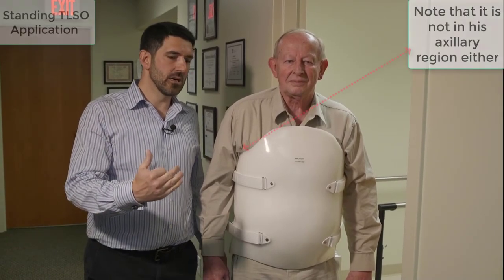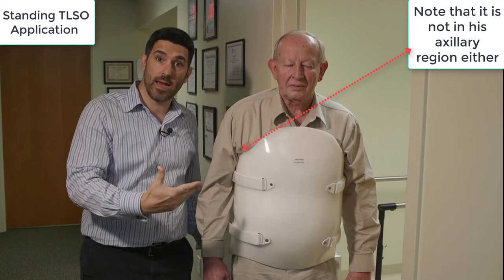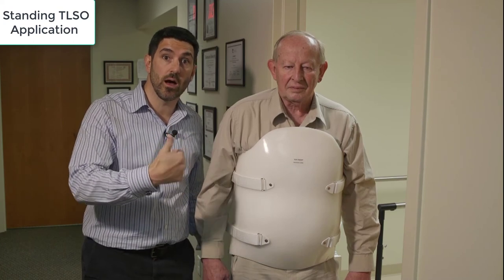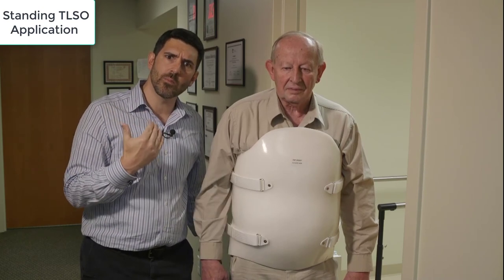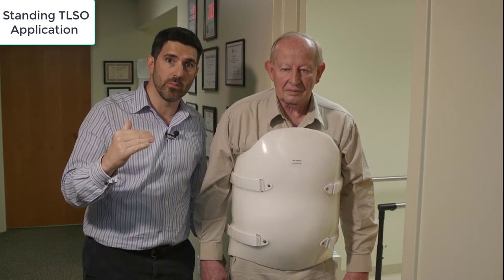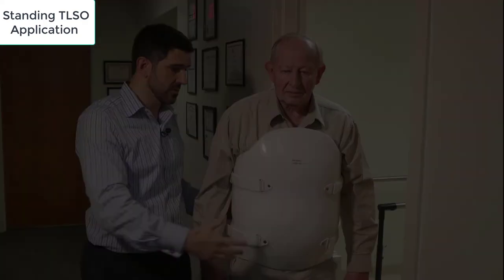Right now Bob is in a straighter position and the brace is not in his neck. We're going to do this same process in a minute with him sitting, and you can see where the problem happens. The whole point is we're trying to teach people who apply braces — whether in a nursing home, a hospital, a doctor's office, when the orthotist is not there — so you have an understanding of why a brace might end up in someone's neck. It's a huge problem, and an orthotist will see it the most, but we can help you apply braces better.